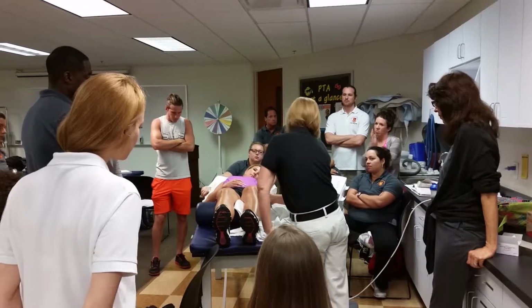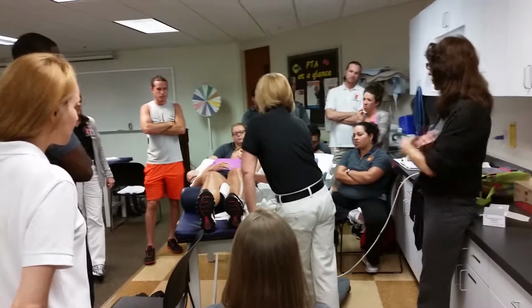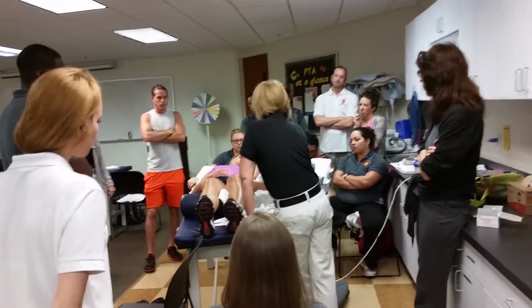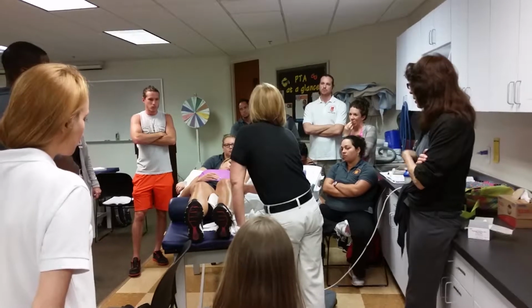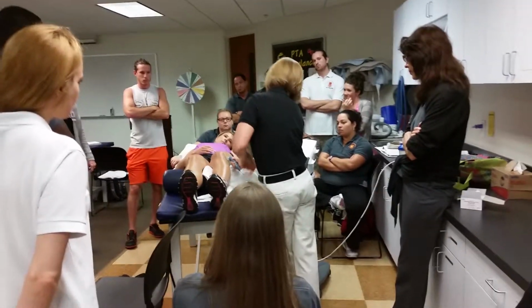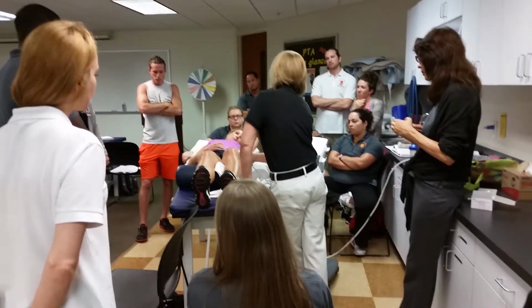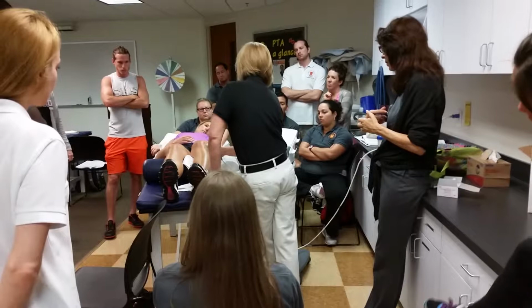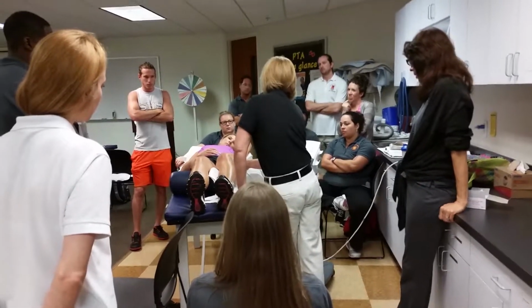So at 1 watt per centimeter squared, which is pretty appropriate, she's feeling it. If you're going over a slightly deeper area and you're moving really fast, you may not feel it. So that's why the delivery can change from person to person. So if I'm delivering it like this, okay, I may have to go up to 1.5. So that is why if the therapist gives you an exact number, it can become difficult.